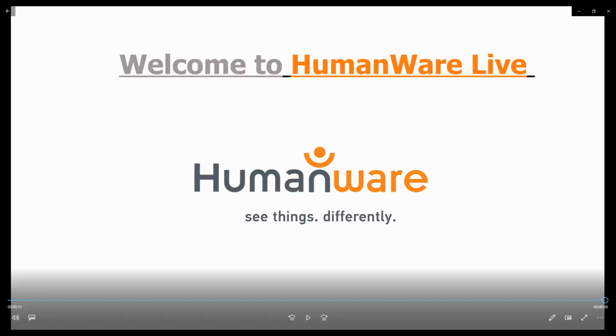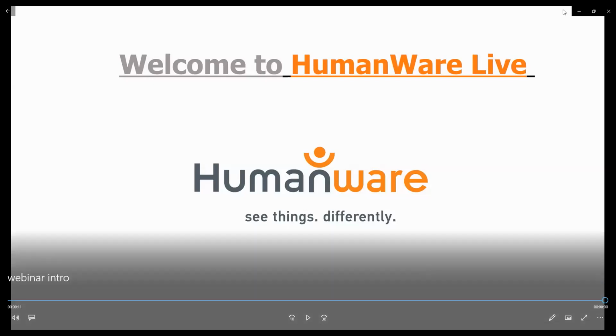I am going to quickly take over screen share. What we're going to do today with HumanWare Live is talk about how we get into a Zoom meeting. I'm going to show you two ways to do that. We're then going to throw it over to Andrew, who's going to talk about the just announced HumanWare Buddy application that we teased last Thursday. And then we are going to come back to me, and I'm going to float us through how to attach an assignment, a keyword assignment, or a keyword document into Google Classroom. And then I'm going to show a couple of tips and tricks for navigating Google Drive.